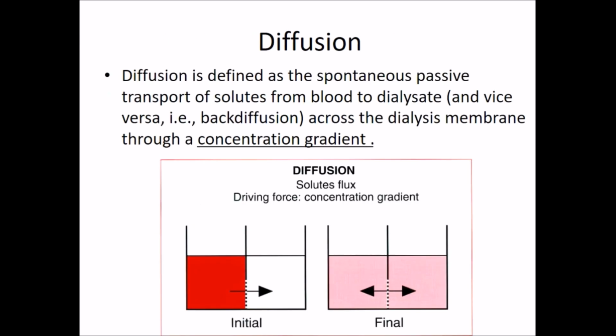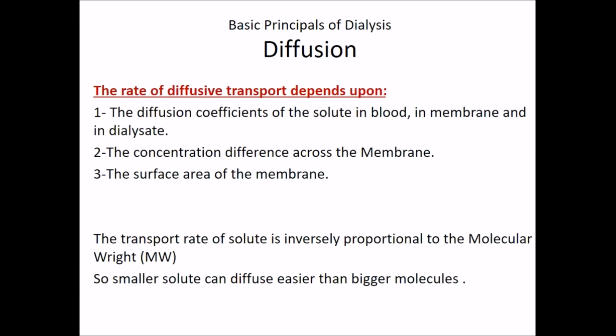Diffusion is defined as the spontaneous passive transport of solutes from blood to dialysate and vice versa across the dialysis membrane through a concentration gradient.